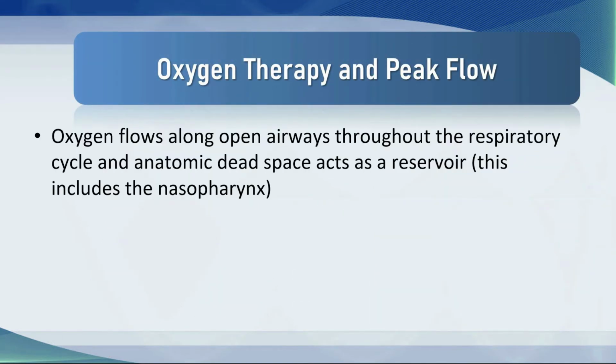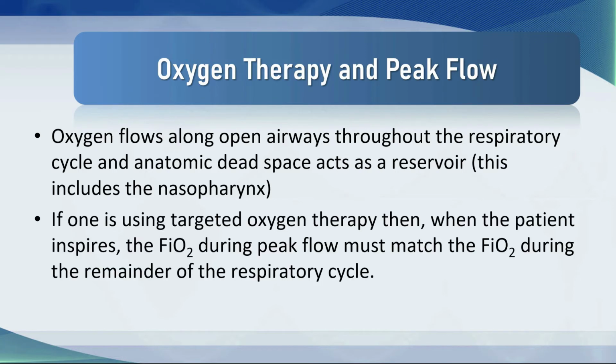So let's summarize that. Oxygen flows along open airways throughout the respiratory cycle, and the anatomic dead space acts as a reservoir, and that reservoir includes the nasopharynx. If one is using targeted oxygen therapy, then when the patient inspires, the FiO2, the inspired oxygen fraction during peak flow, must match the FiO2 during the remainder of the respiratory cycle.